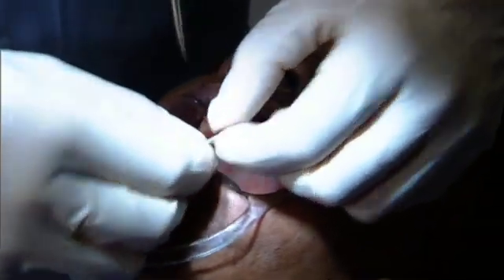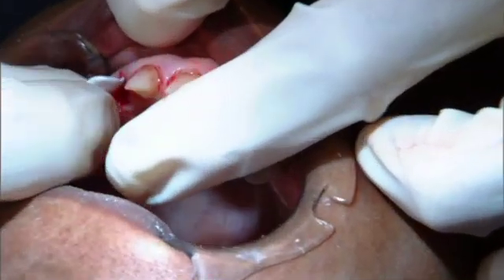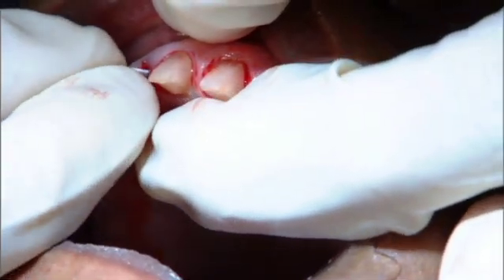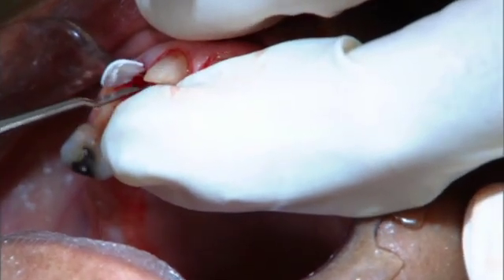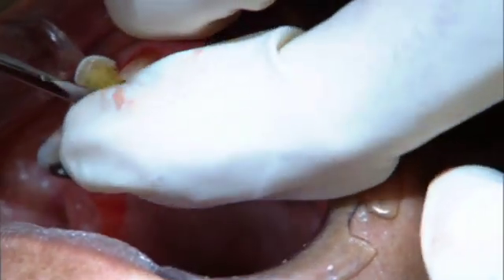We've got the other side of that barrier for the other socket. We'll slide it right down and kind of decide if it's long enough or too long. I'm going to take just a little bit off. This is particularly helpful if you've lost a buccal plate of bone and you're having to graft to get back the buccal plate. Okay, now with that barrier in place, I'll then put my graft material.